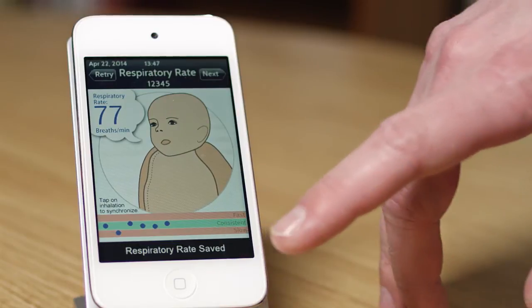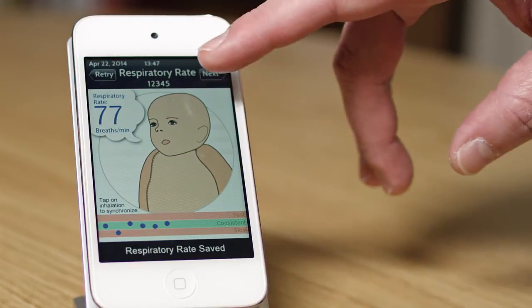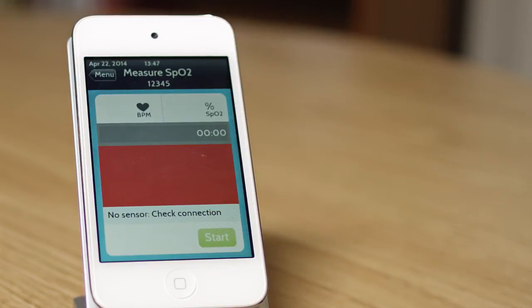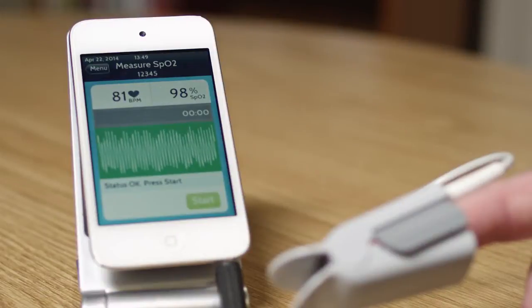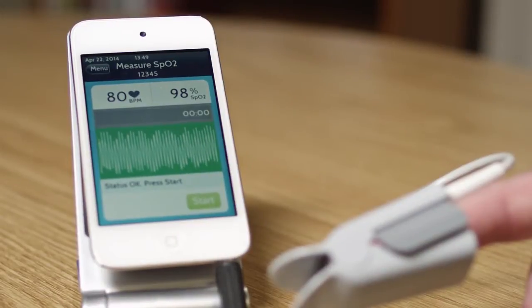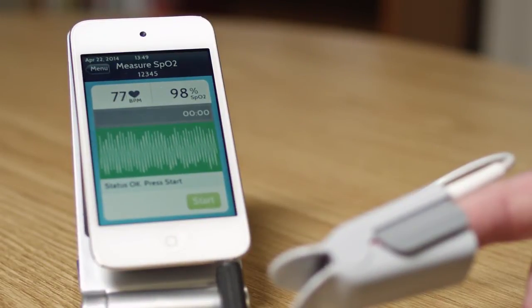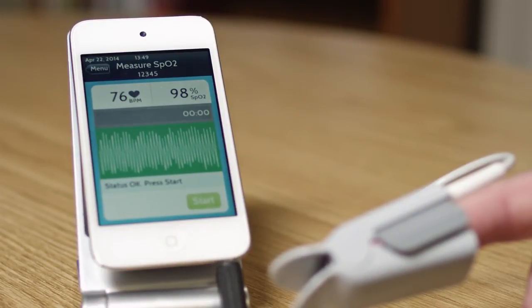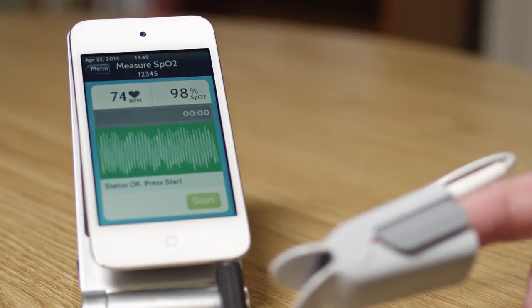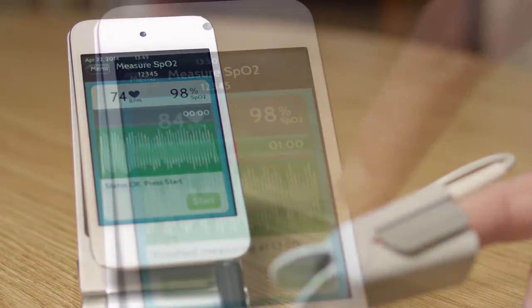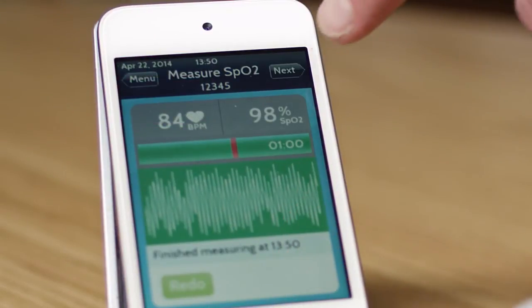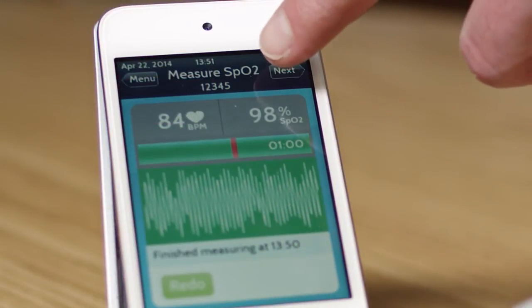We can then go on to measure the oxygen concentration in the blood using a pulse oximeter sensor. We use the audio connector, and we get a signal that shows the pulsation of the blood in the finger and also the oxygen concentration. I'm going to save this and continue on.